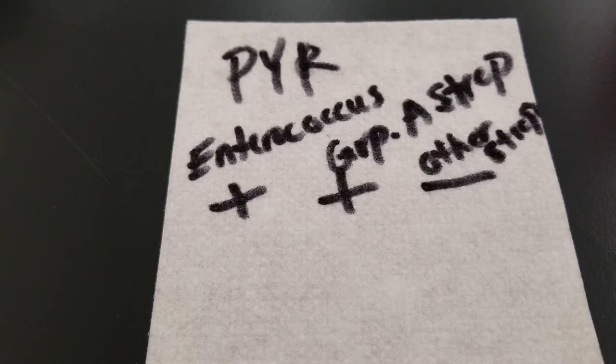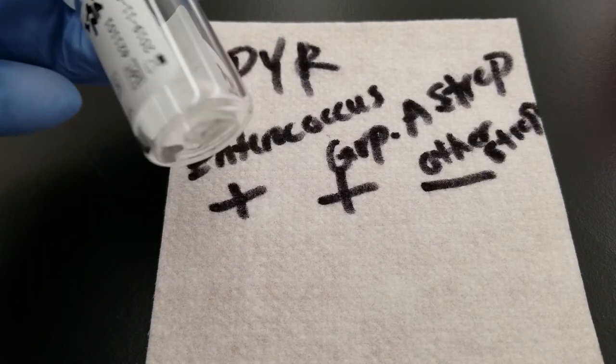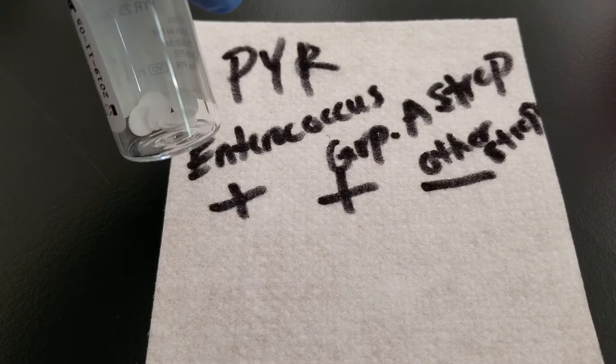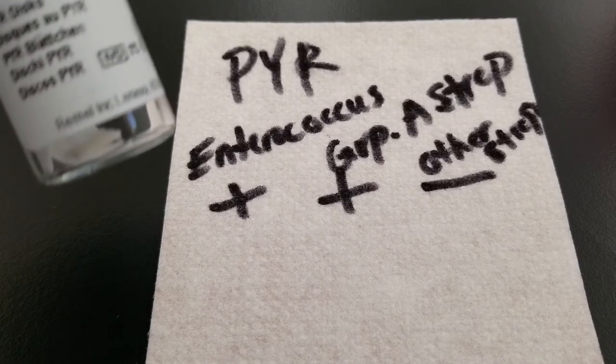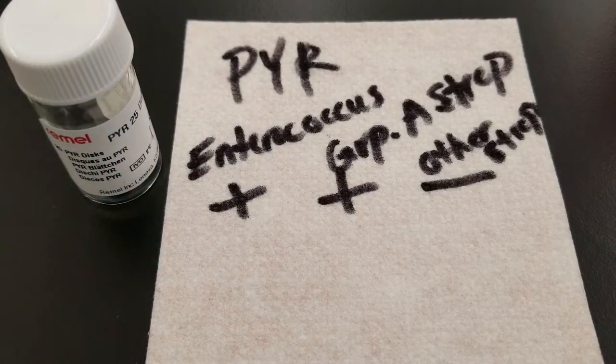This test kit comes with reagent or substrate impregnated discs — little filter papers that have the reagent inside of them. What we're going to do first is pull those out, get them wet, and then add the organism to them in order for the organism to try to break apart and utilize the substrate.